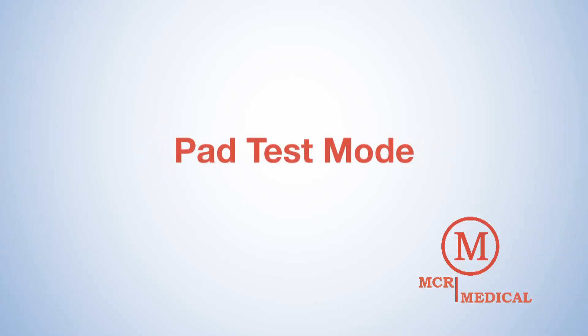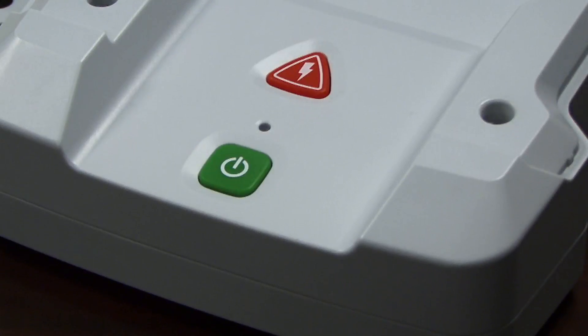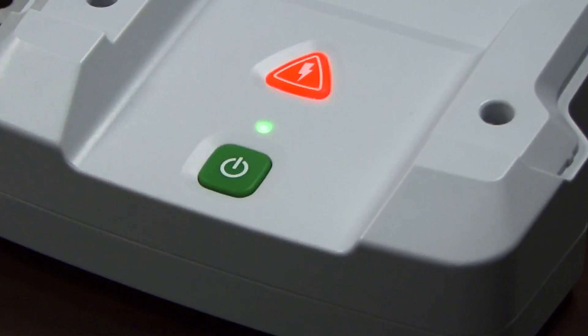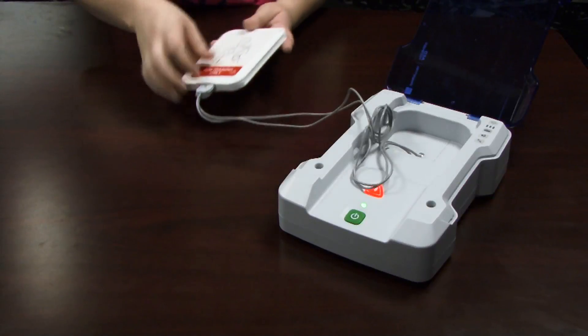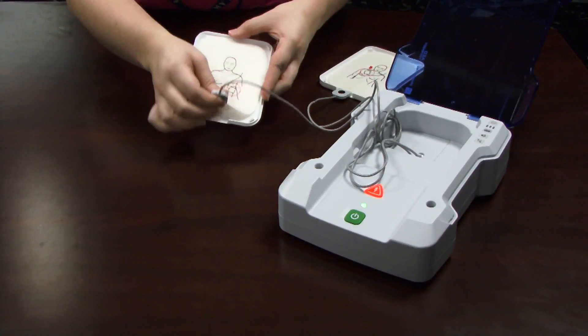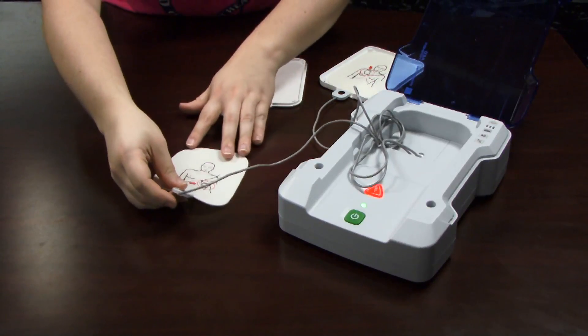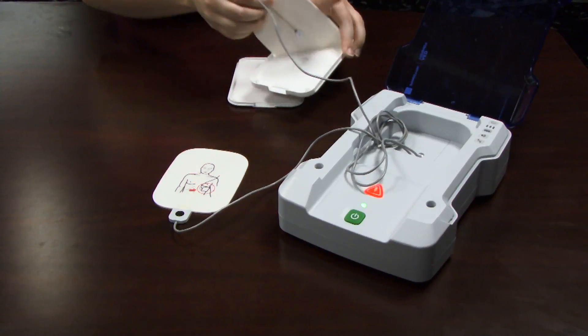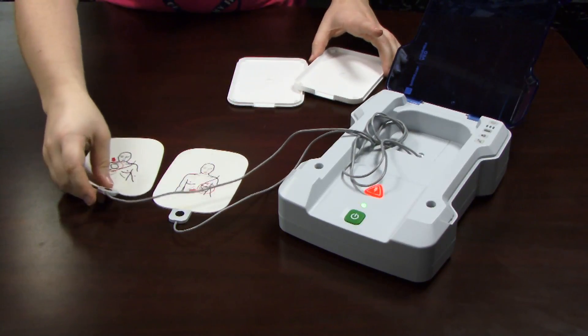Wondering if it's time to replace your Preston Professional AED Training Pads? Finding out is easy with the unit's pad test mode. To initiate the pad test mode, hold the green on/off button for five seconds until you hear a single beep. The red shock button will flash. Take the pads out of their training pad case. Place the pad on a flat surface, graphic side up. Lightly press the pad switch and listen for the beep. Hear the beep? That means the pad is working. No beep? It's time to replace the pad.